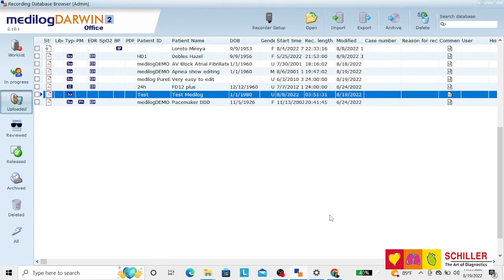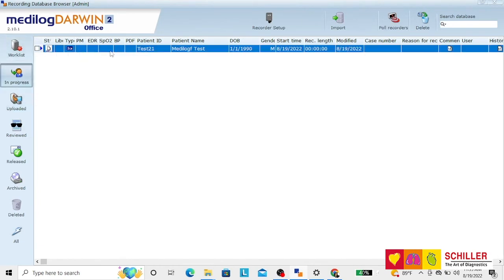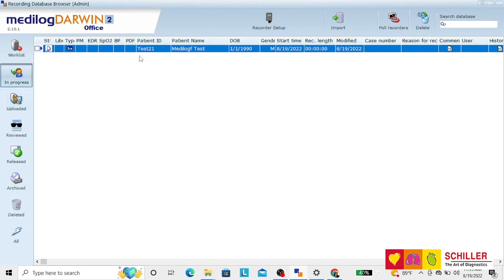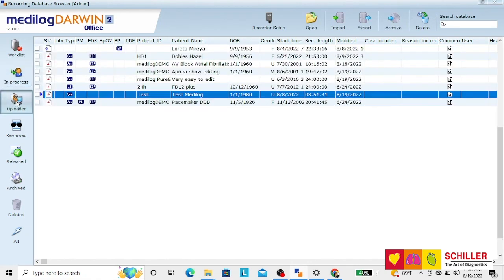now the configuration is on the recorder. If you go to the icon in progress, you can see that patient we have just prepared now has the recorder with him. Once we download the recording, it will be automatically paired with this data and will come to the uploaded icon.